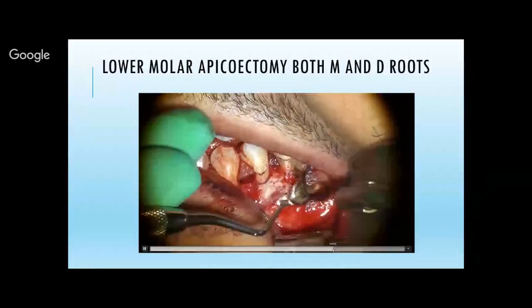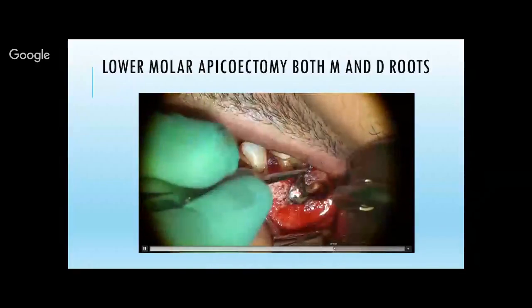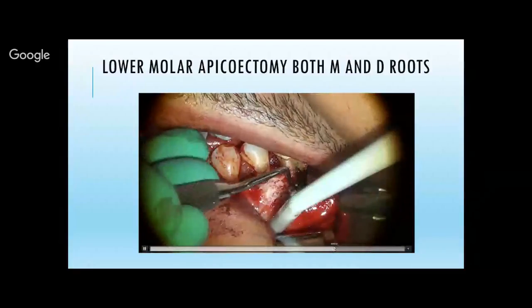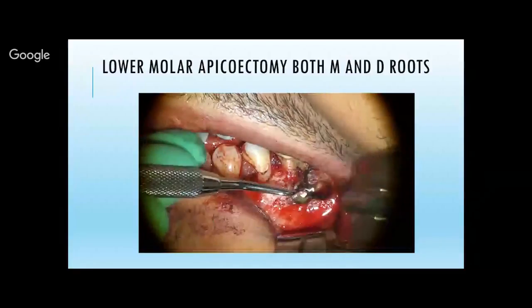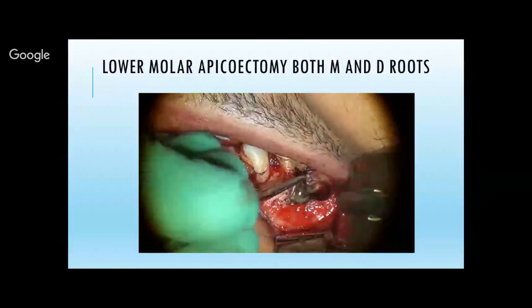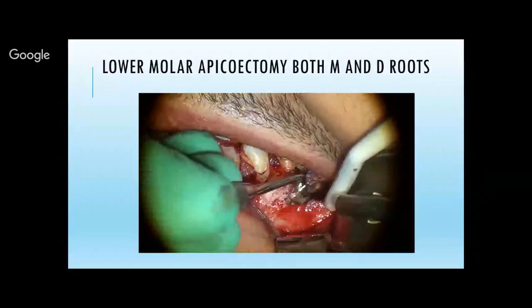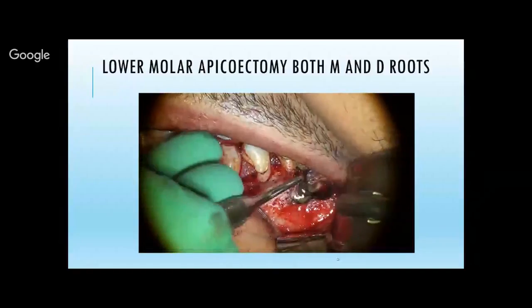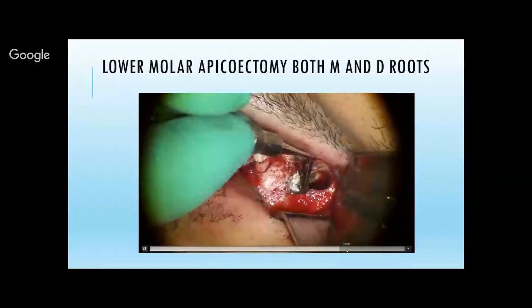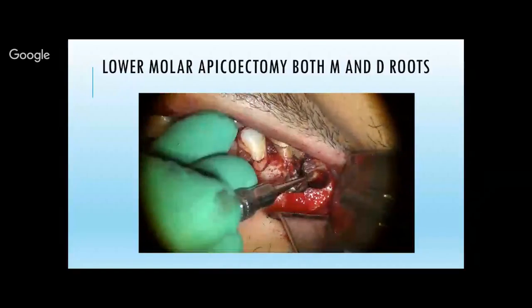Placing, this is BC putty, which is MTA putty. Using retro pluggers to pack it in. Oops, sorry.